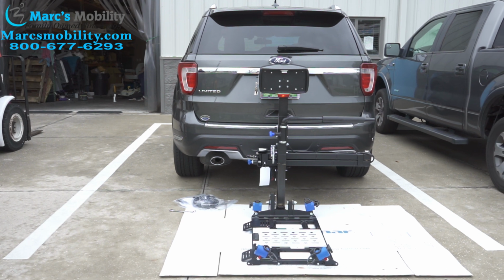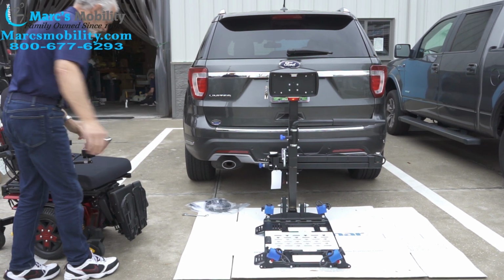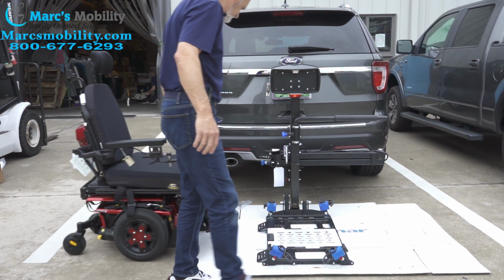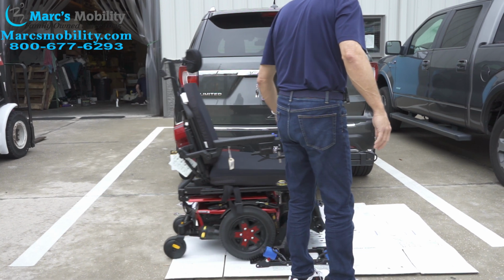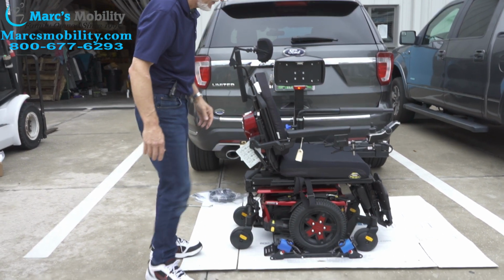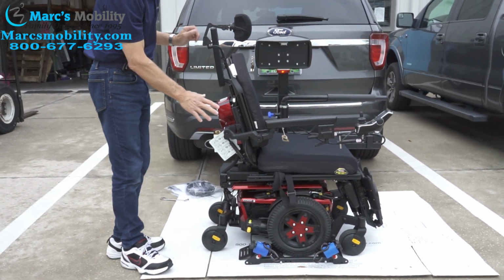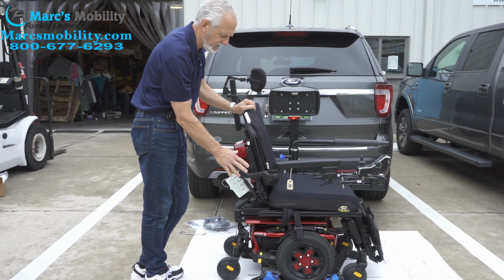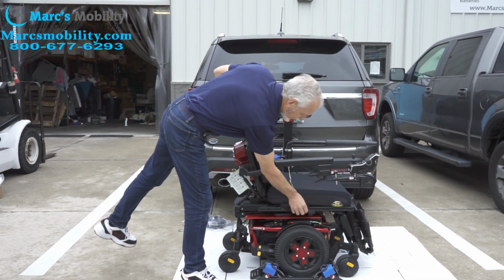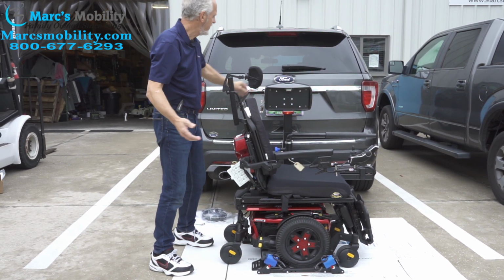So you'd bring your Quantum chair like this one here, until the drive wheels are inside the middle track right there. And this lift is already set up for this heavy power chair. And then you can raise the lift up before you put your straps on. You can do your straps first. I like to raise it up so I don't have to bend as much.